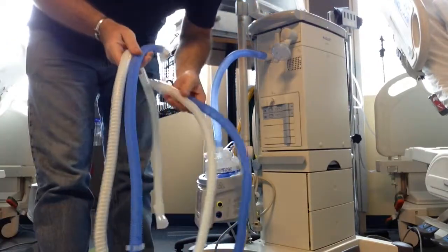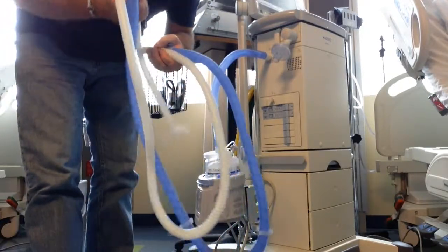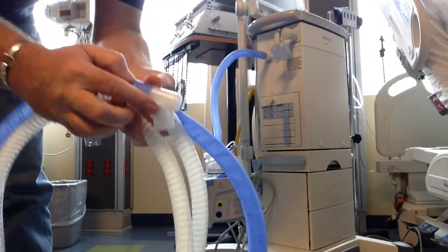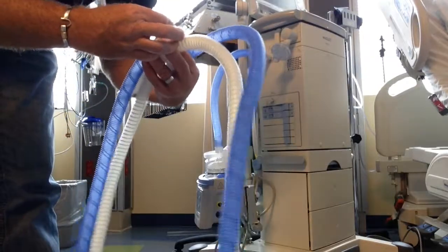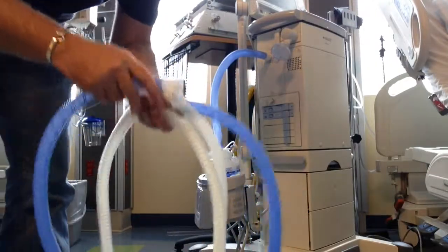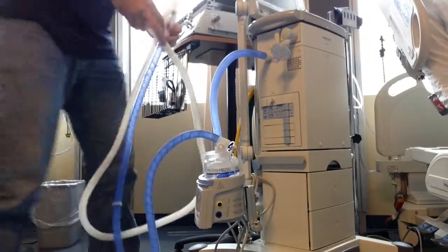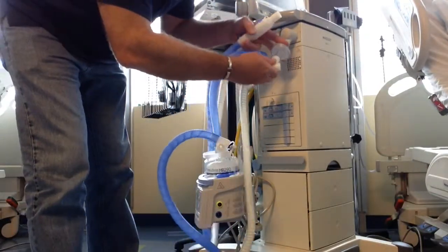My circuit has a blue and white side — this is an Evoqua circuit. Typically the inspiratory side is the blue side and the expiratory side is the white side. Usually there is a cap here that you would pop off, and this would go on the other side of the heating chamber. Make sure the hose is not twisted, and then the expiratory side — the end of the white — goes right here on the expiratory port.